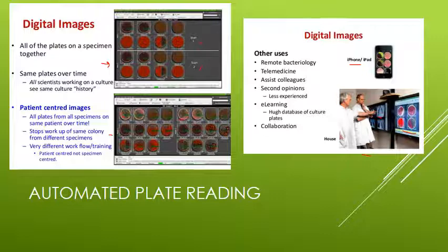It's not just, well, my hospital does it this way and your hospital does it that way. It's like, hey, let's all look at this. We're trying to treat this patient the best we can. Is it an expensive endeavor? Yes, it is. But the fact that you wouldn't have to look at any of those no-growths, I see that as a great cost savings in tech time.